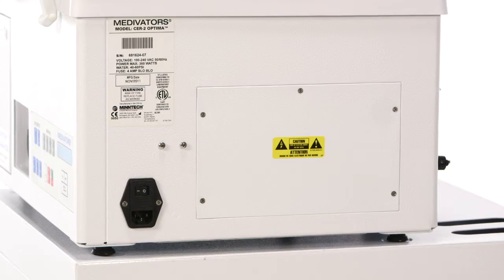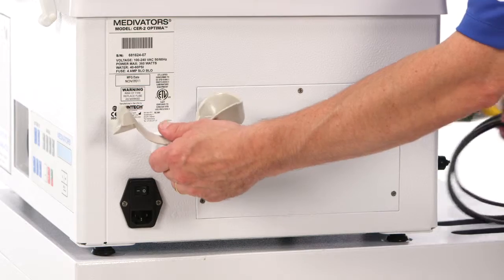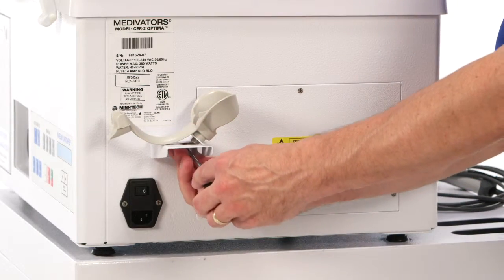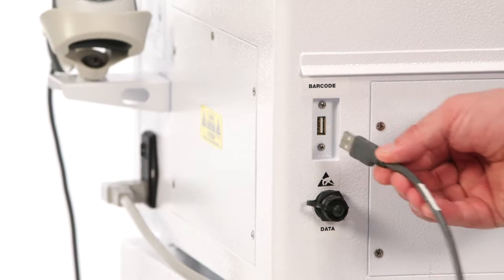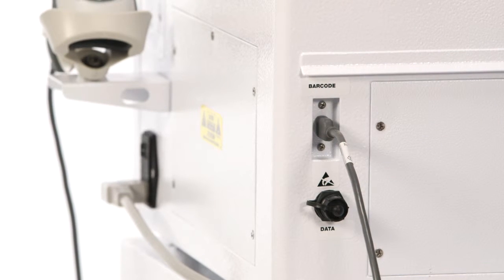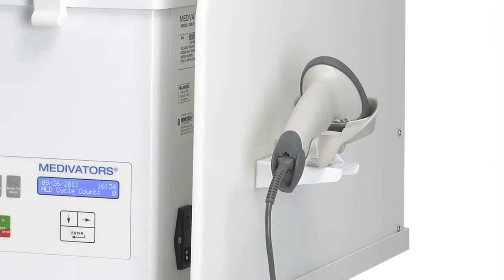To install and connect up the CER Optima unit, locate the CER barcode reader and bracket. Connect the bracket to the right side of the CER using the two small Phillips head type mounting screws. Place the barcode reader into the bracket holder. Insert the barcode reader cord end into the connector labeled barcode located on the back of the CER unit. If using the vapor management hood, the barcode bracket will not be placed onto the CER unit but rather mounted to the right side panel of the VMS hood.